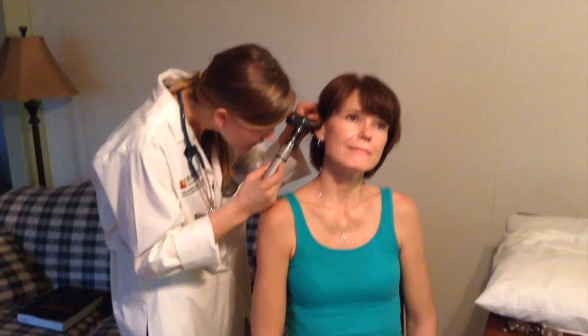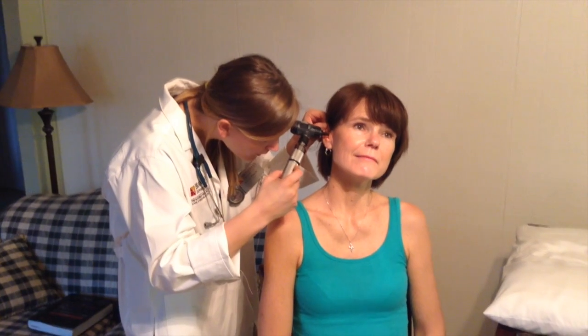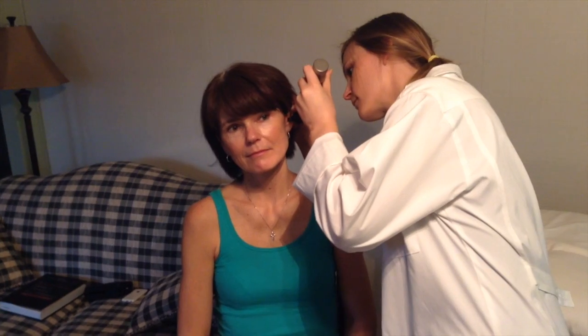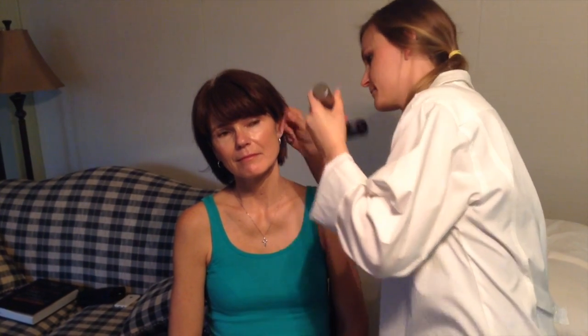I see a little bit of earwax, but overall, I see a nice pearly gray tympanic membrane. I'm going to come over here and do the same thing. Pulling up. Great. Okay. Now I'm going to do a couple of hearing tests.